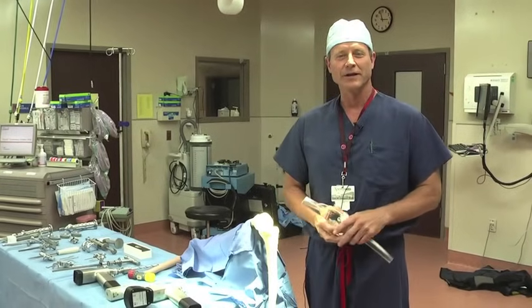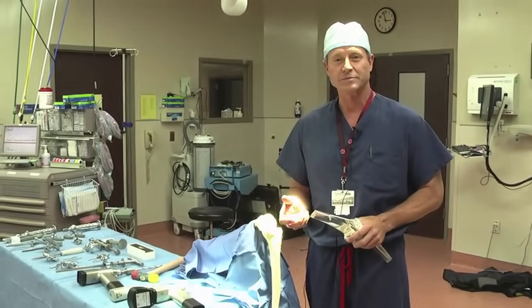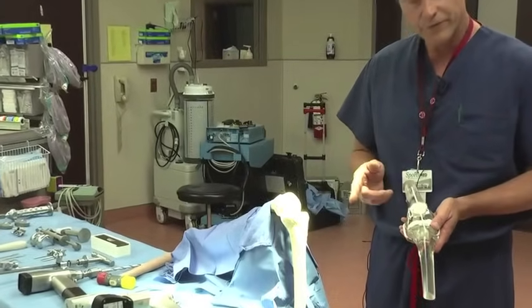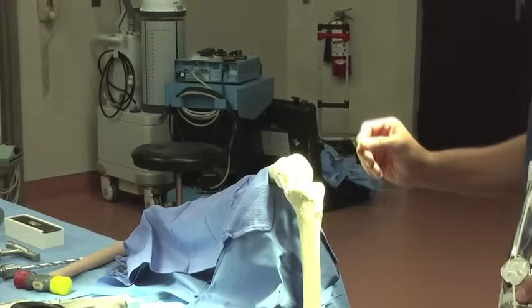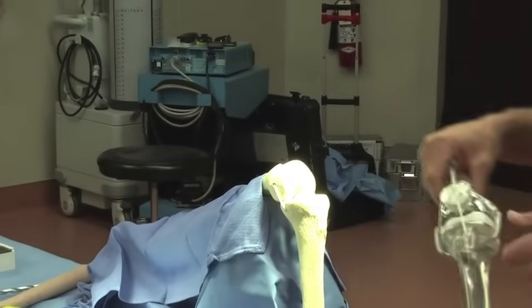Hey, I'm Dr. Eric Janssen, and today we're going to demonstrate what we call a dry bones model for total knee replacements. This is just a model of the femur, the thigh bone, and the tibia bone down below. When we first make our incision, we make a skin incision directly in the front of the knee, and then we go inside and actually rotate out the kneecap to get to it.